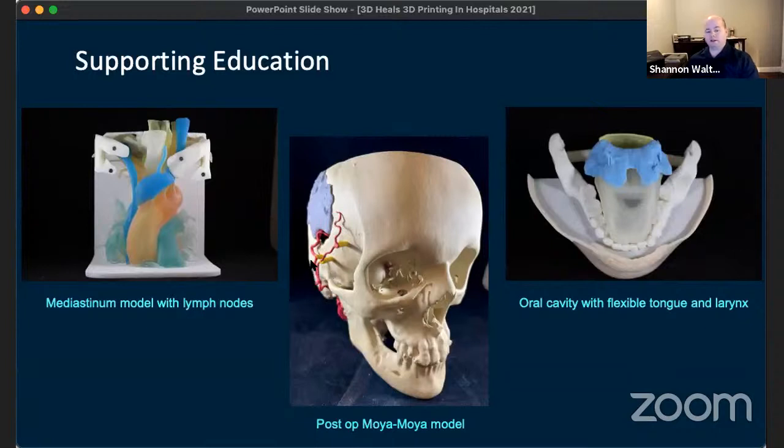They show how they're accessing the external carotid. They're going to create a titanium secure fasteners here and pass this through. And if you look at the other side of this, you'll see that it's connecting into their brain vasculature. And then this was more about explaining to pediatric patients, to their parents, what the procedure is going to be to fix cleft palate or whatever condition this particular one is. I can't remember all the details because there's so many things coming around.